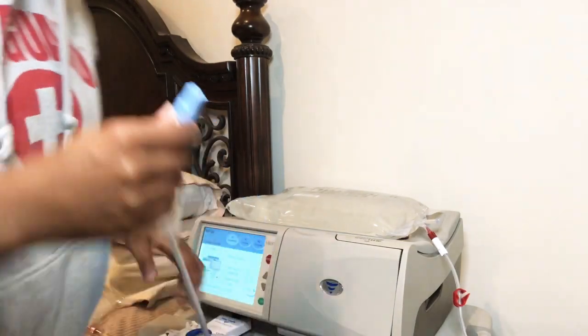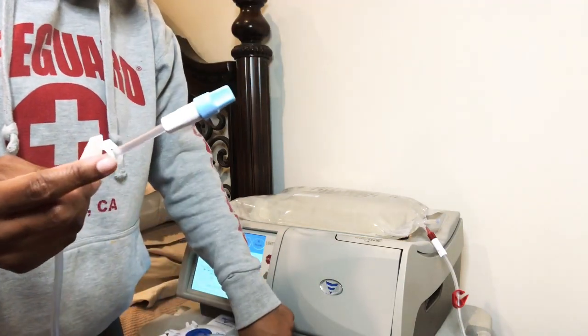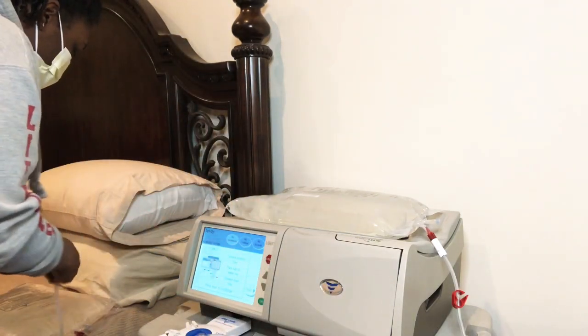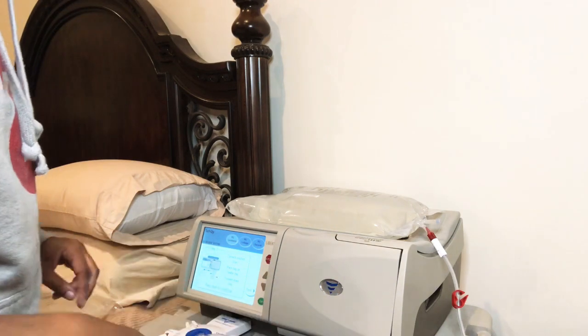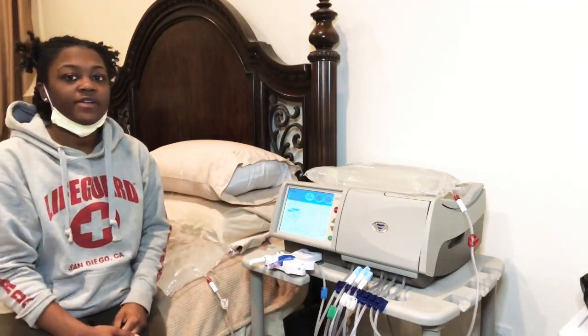And then for my second bag, the first white one, the white clamp, that's gonna be next to the heater bag. So I'm gonna do the same thing on this side. All right, and that's finished. And then we're gonna go ahead and hit next. All right, so now you're ready for the next step.